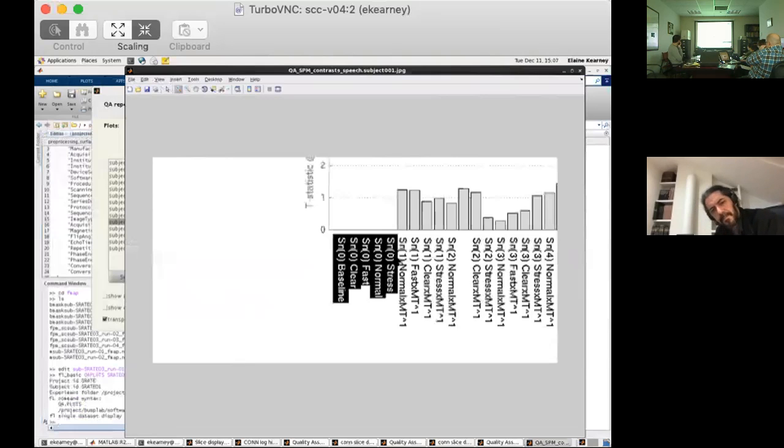I don't know. Typically, when you cannot individually estimate that, but you can estimate the contrast, that typically just means that there is some redundancy in this data, so you cannot estimate one of those uniquely. Oh, yeah, probably it's just the baseline, right?